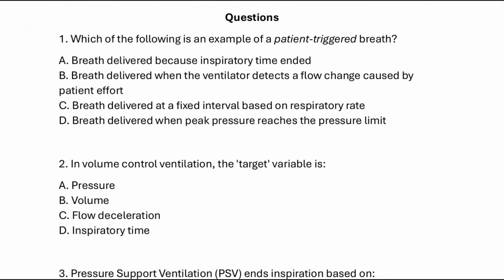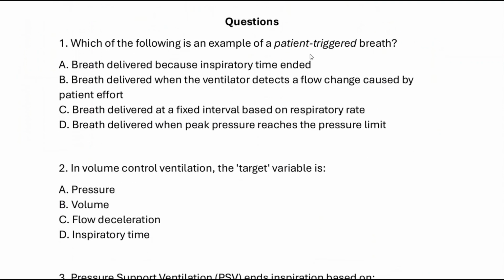Let's do some questions together. Which of the following is an example of patient-triggered breath? So what do you guys think? Very good. A breath delivered when the ventilator detects a flow change caused by the patient effort. So that would be a patient-triggered breath.